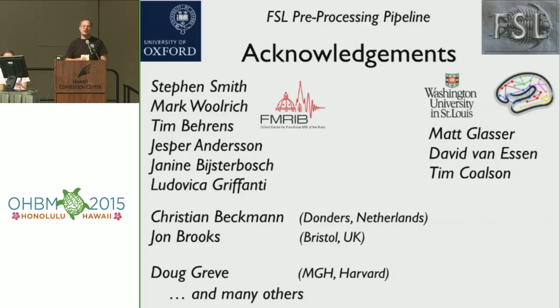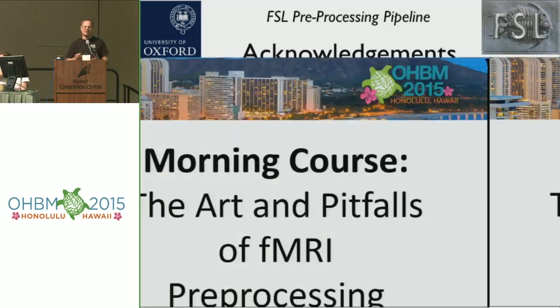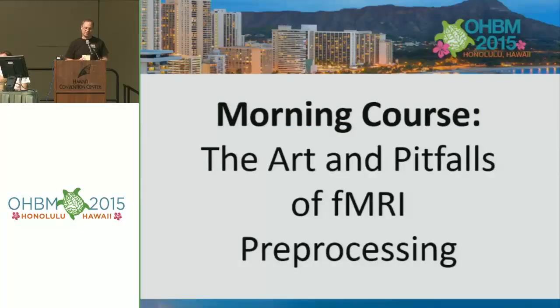Right, so our guidelines for task-based fMRI are a fairly small amount of smoothing. We would typically recommend something like a voxel and a half as the full width at half maximum. The main thing is that on average we are increasingly recommending no smoothing in the resting state data, but it really depends on the quality of the data as to whether smoothing buys you anything. But it's quite common that we are not doing really any smoothing.